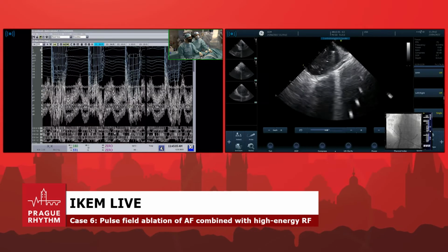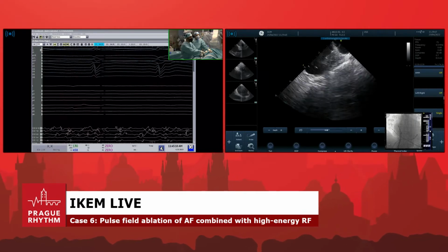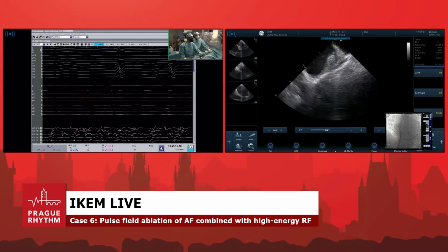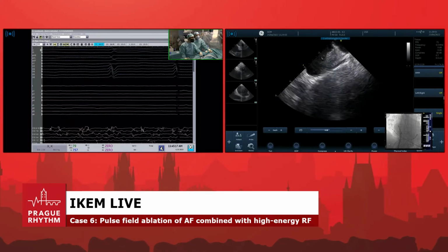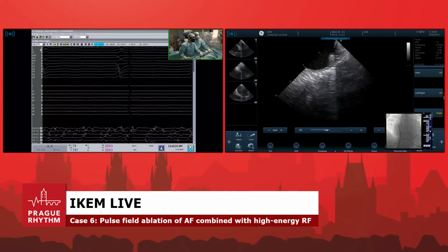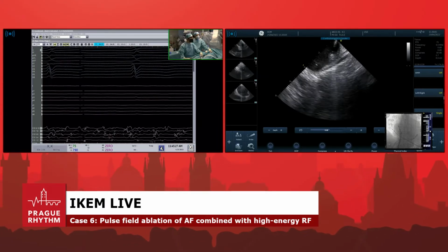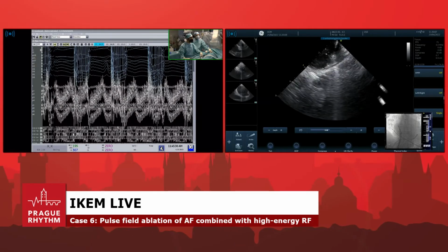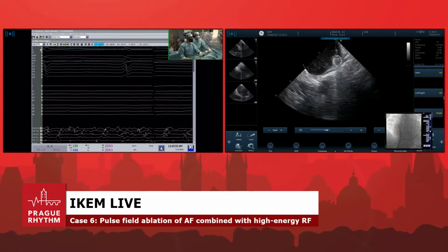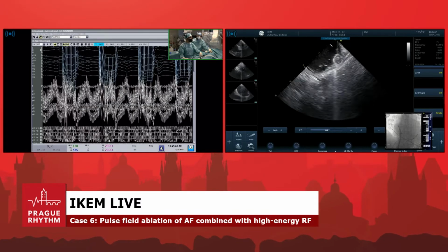Can you do view 1, please? Can you show us a little bit lower? Yeah. So you will do now a circle on the right side, and then we'll isolate the right veins, and then we do the posterior wall box. Now electronic capture. I do. Can we see the map maybe? Because there is not much to be seen on this screen anymore.